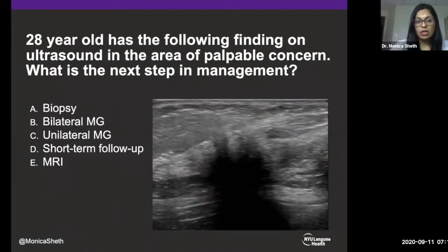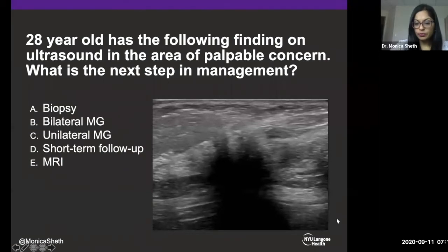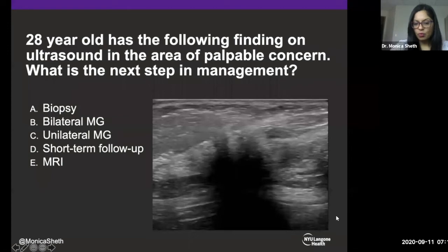Now we have another 28-year-old with an ultrasound of the area of palpable concern showing the following finding. Options for next step: A — biopsy, B — bilateral mammogram, C — unilateral mammogram, D — short-term follow-up, or E — MRI. Answers coming in include A, B, some C, and one E.